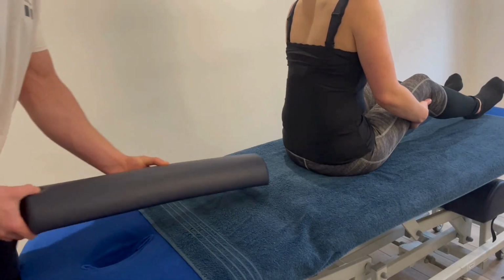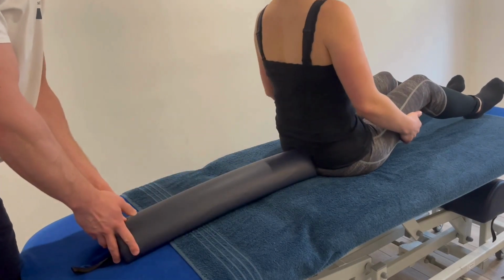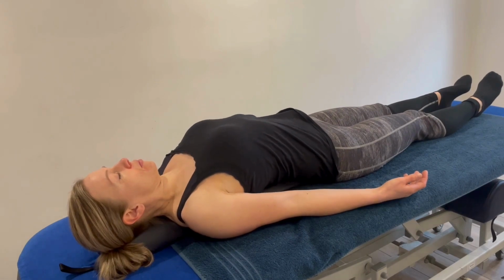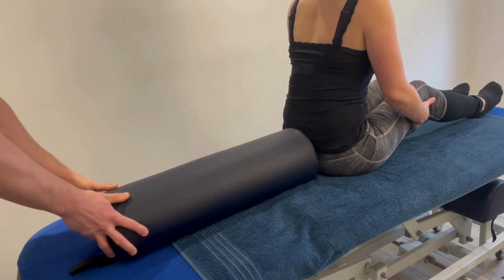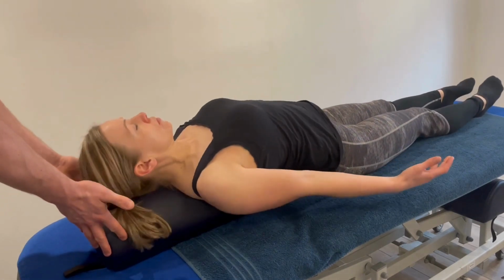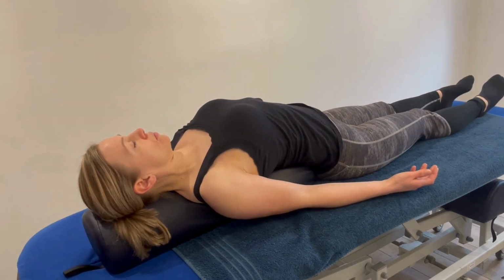An alternative use for the bolsters is to place it lengthways down the spine with the client in supine. To do this, we're going to pop the bolster up against the sacrum with them seated and then encourage them to lie back. We can use the half round bolster initially, or we can go to 3/4 round, but just make sure you've got that flat edge, so not the whole round bolster, so that they've got that solid base to lie back on. And you can get them in a nice stretch position, either for treatment of the pecs and anterior neck, or for METs and STRs, for areas such as pec minor, pec major, and the internal rotators of the rotator cuff.